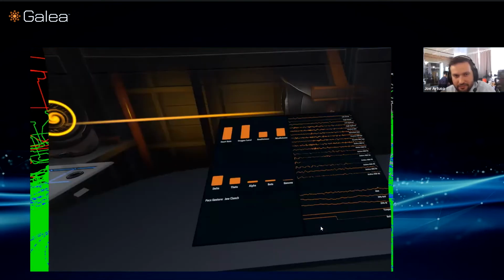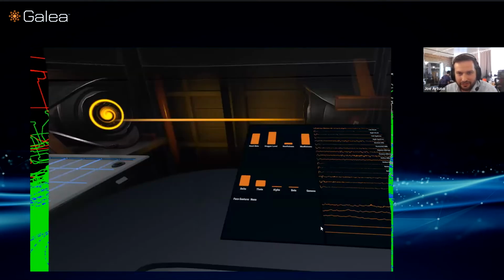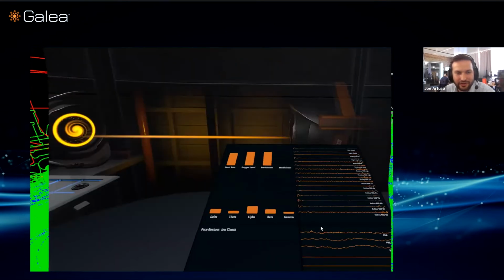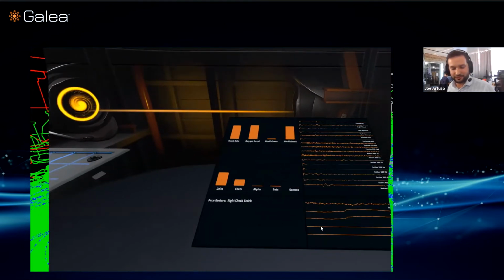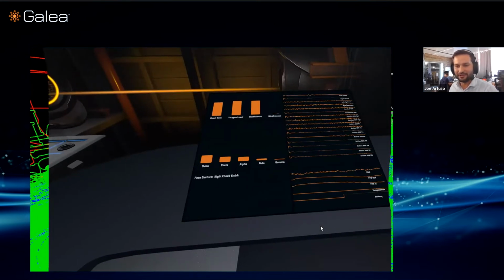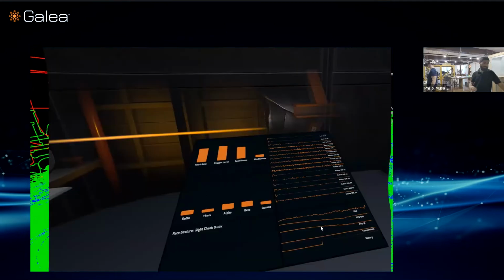And Phil, if you can, try and keep focused on the graphs. I know as you gesture and your head moves, the frame rate is messing with us. But yeah, sure. And I think once you get through some of the description of the metrics, let's try the breath holding thing one more time on a new screen share. Yeah, because I think we cut out the demonstration of the breath holding, so we'll do it one more time.